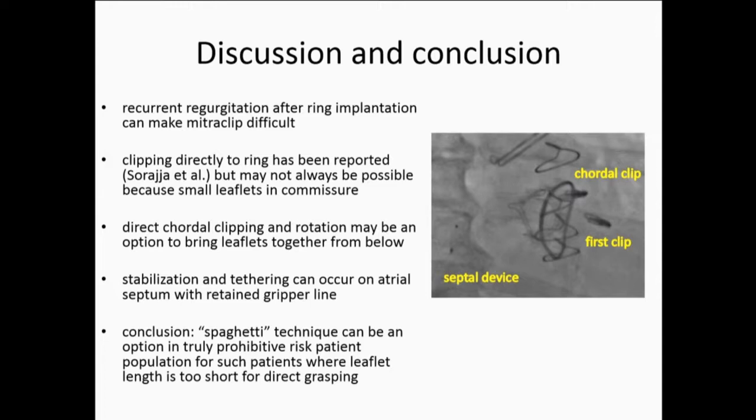So Danny, question for you. Laceration, or a BASILICA to remove a clip that's SLDA? But then, well, where will it go? I thought you said I was brave. That's really brave. Put it in a snare and then do the slicing. It's doable. Yeah, and pull it out the aorta? Yes, I think that it's doable. Never did it before. I imagine that it could be. Danny, we'll make a bunch of patients for you, and we'll send them right over up the street.